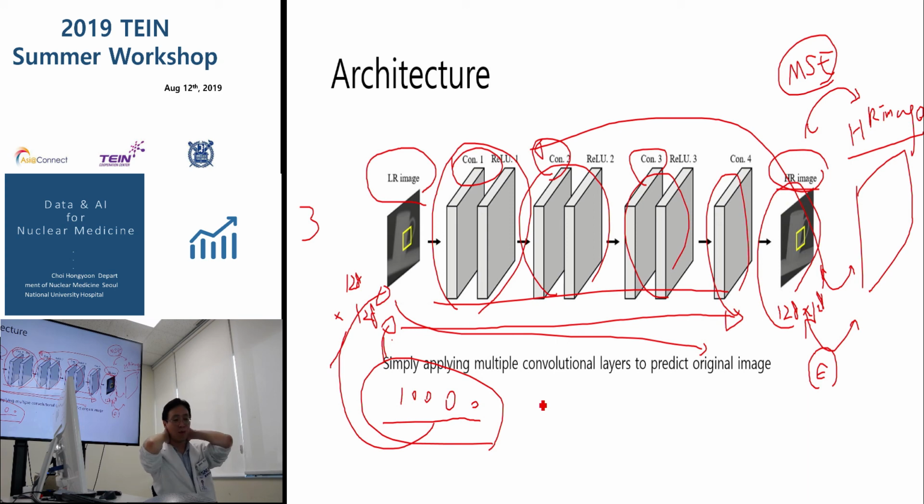And even more, the most important objective of the CT acquisition for PET CT is attenuation correction. But recently, Jason Lee also developed a deep learning model to generate the attenuation map from the PET only data. So this type of PET-based attenuation correction can reduce the requirement of the CT for PET CT.